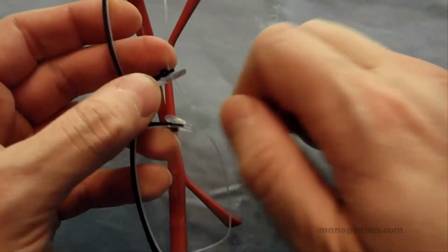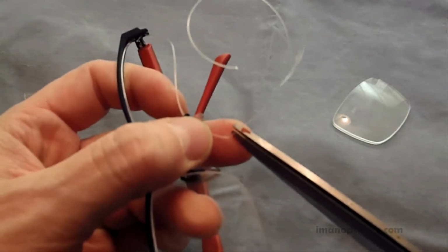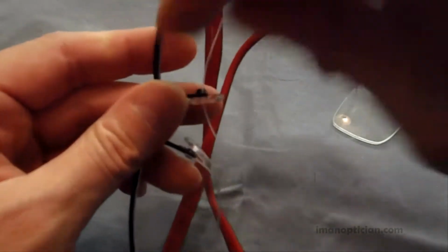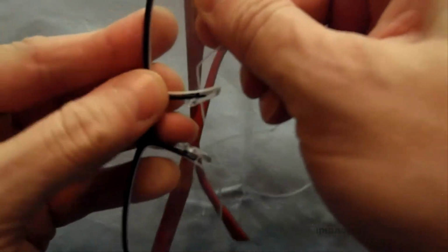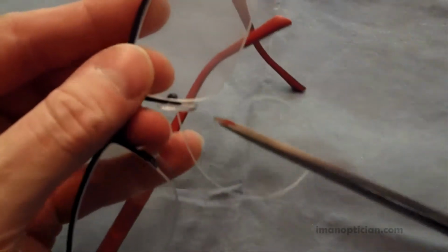So if we pull that crimp out here, and then we want to cut it about 3 millimeters, 2 to 3 millimeters past that crimp, or if you leave the lens in, you can actually just cut it while the lens is in here. So again, put it in there, pull this nice and snug, nice and tight like that, and crimp it down. And then you want to cut it with about 2 to 3 millimeters of a tag right there.